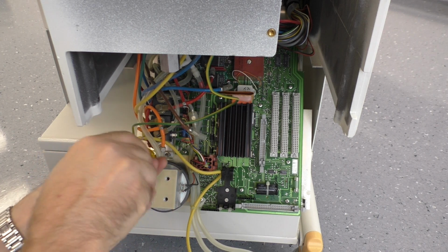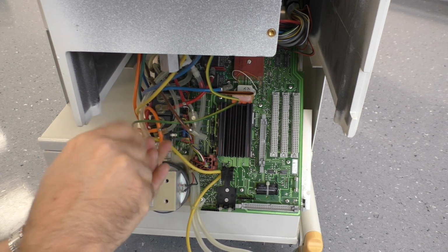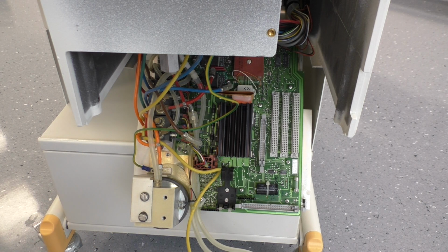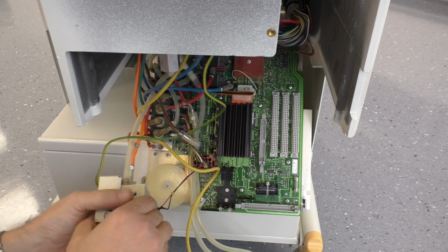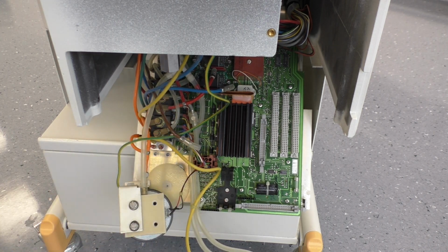So let's see what this thing here is doing. Maybe it's a small pump for something, or a valve. Okay, I need a cutter.